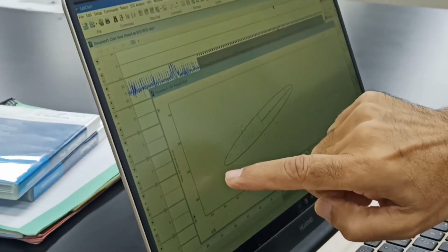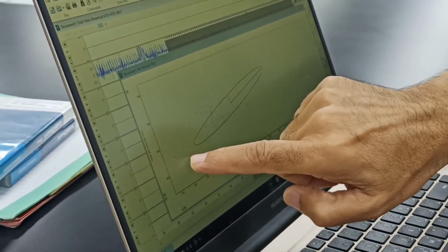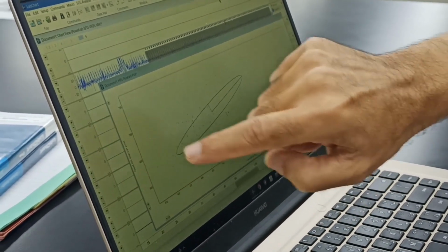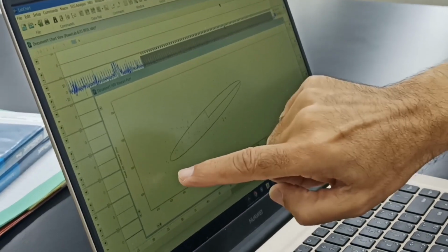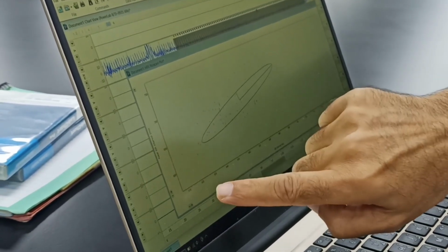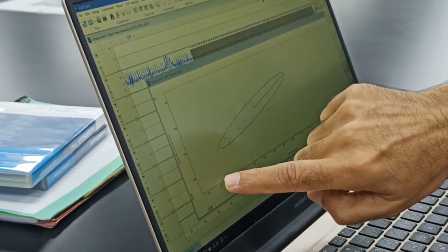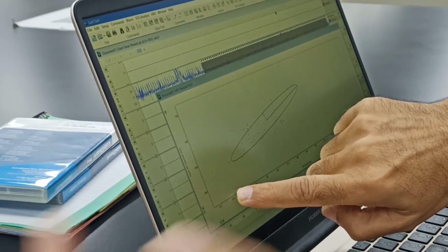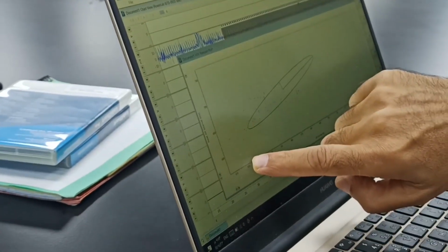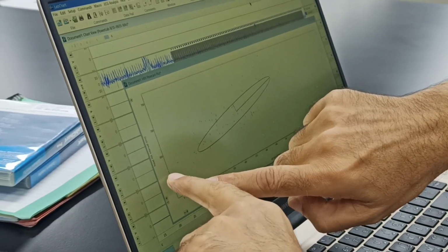So for example, this is a point which is showing you the first RR interval, that was something around say 622 millisecond. And immediately the following RR interval, we call it RR plus 1, was 630 milliseconds.